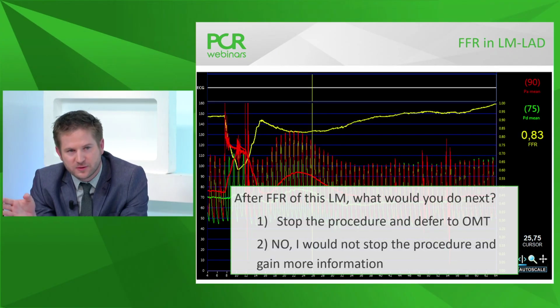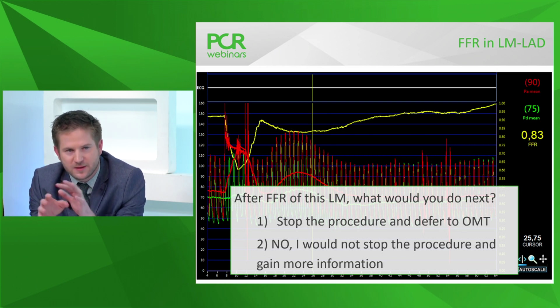You know, Emanuele, I really like the way you performed this functional assessment of this left main disease. You measured the circ, most probably in the very distal circ. You measured the LAD in the very distal LAD. In this way, you get a full functional mapping of the left coronary system, including the left main and all potential bystander lesions or narrowings.